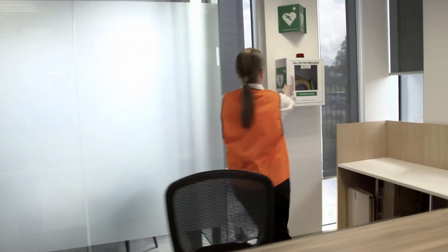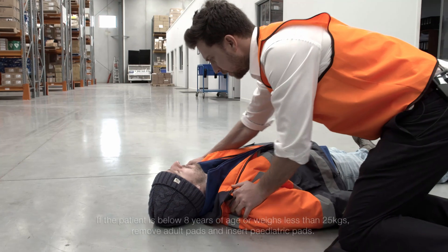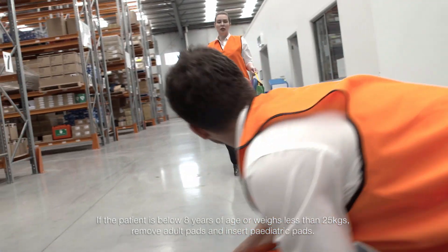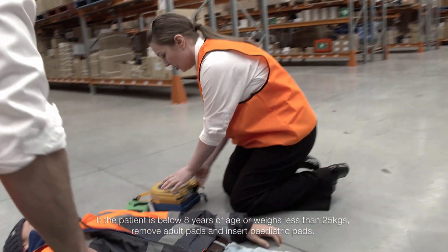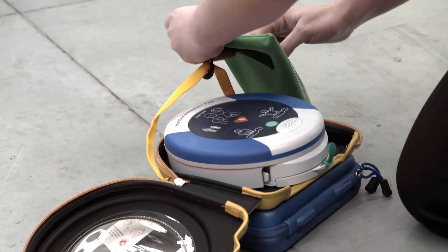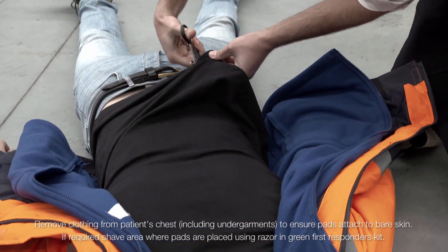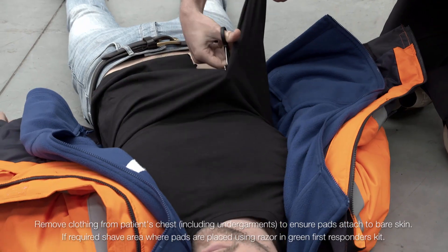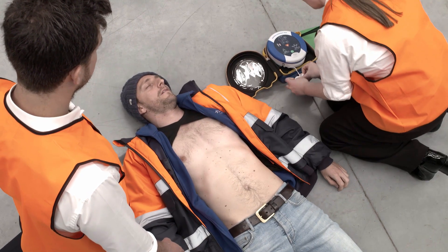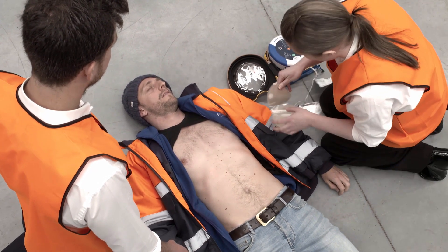The HeartSign 500P is simple to operate and will guide and coach you through the rescue with easy-to-follow verbal and visual prompts. If the patient is below eight years of age, remove the adult pads and insert paediatric pads. Press the green on button to turn on the defibrillator and call for medical assistance. Remove clothing from the patient's chest to expose bare skin, then pull the green tab to remove the pads. Peel the pads from the liner and apply them to the patient's chest as shown in the pictures.